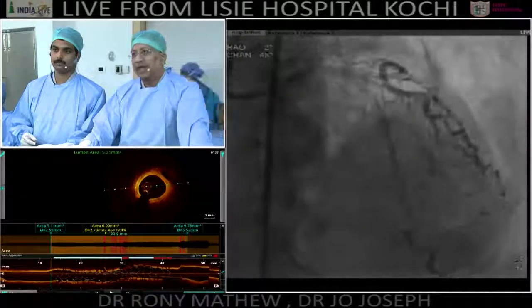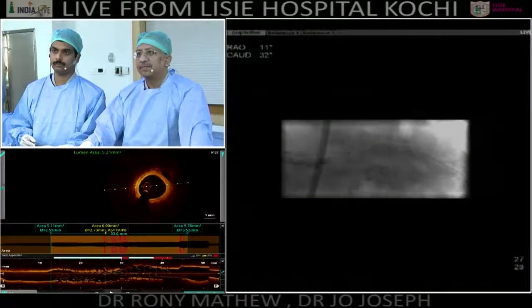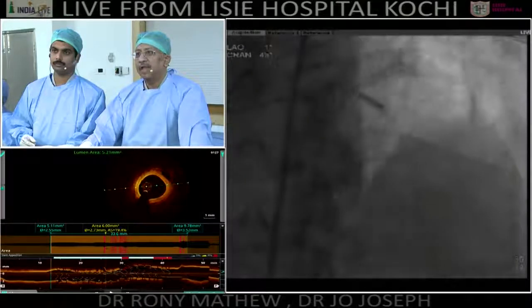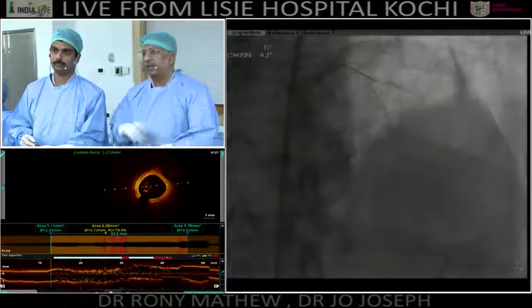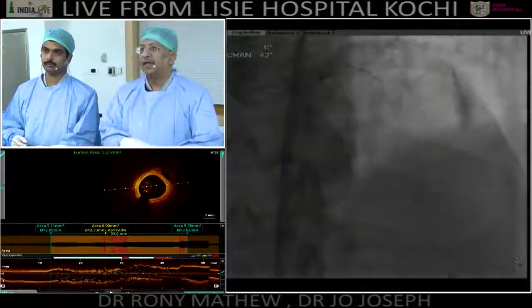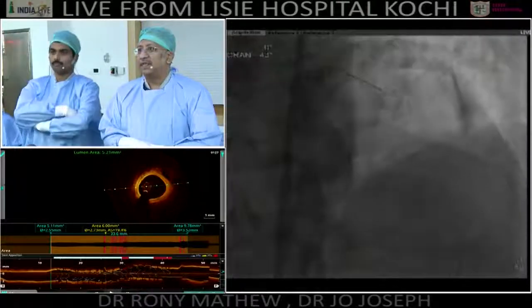At this point again, next, we saw the proximal. I did a POT. Next. Now again the same thing, recross from the proximal strut. You see, it's recrossing from the proximal strut. But of course, we'll confirm, and I think then subsequently go next.